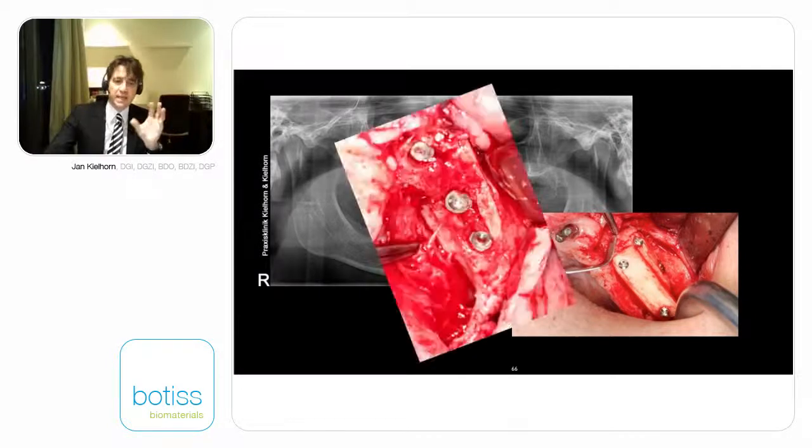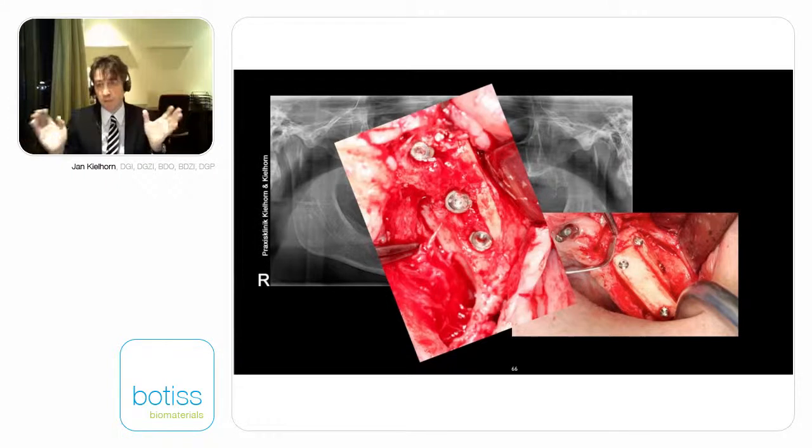Also, you see, in the beginning we had them very thick. This also worked, but we don't want these thick bone plates, so now we reduce them to a size of only 0.8 to 1 millimeter, because we don't want to have this thick cortical plate. But it will lead to a very nice result, even if there's no bone at all.